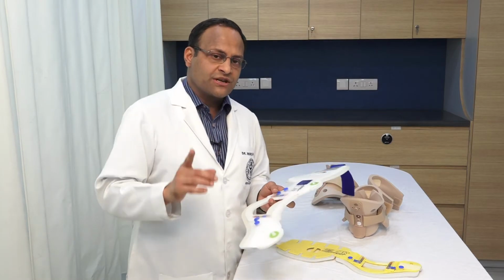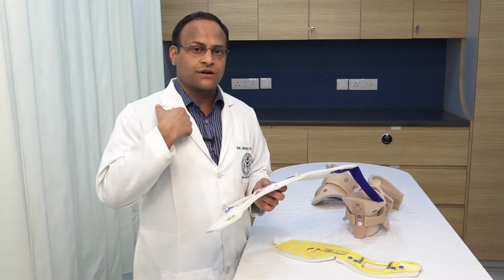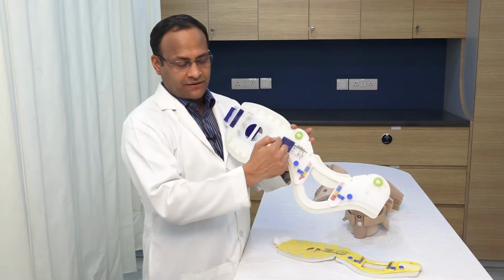Now the measurement remains the same. So we have to gauge the distance between the patient's lower jaw and the upper part of the shoulder by using the fingers, and then that should match the side part of it.